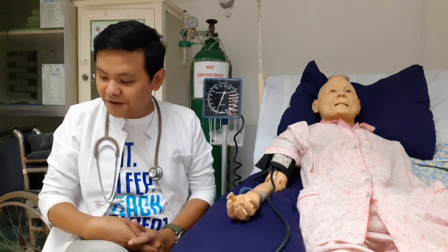If the client is on a sitting position, be sure lang na yung paa po niya is it touches the floor. Hindi dapat nagdadangle. Bakit? It can change the BP. To tell you honestly, kapag nagdadangle yung paa ng pasyente natin or hindi nakasayad yan dun sa floor, there's a possibility actually that the BP might change. Ano nangyari yun, sir? Okay, there's actually rationale kung bakit ginagawa natin yun. And that is something that you're going to tell in our return demonstration.